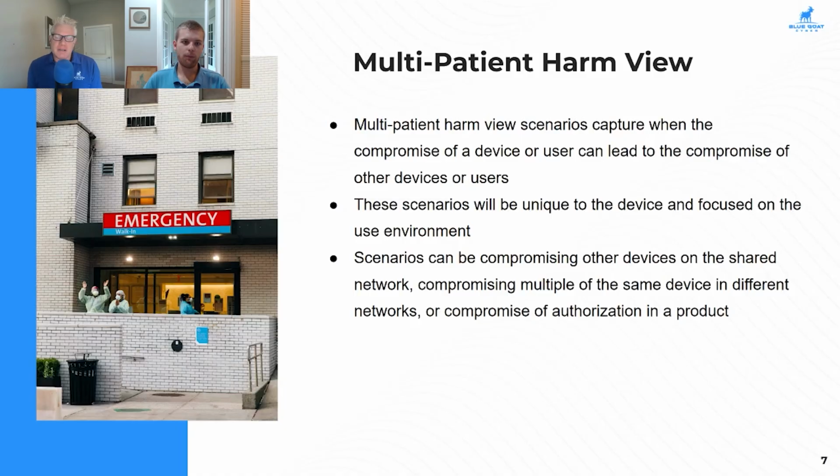So the multi-patient harm view, I think, is a critical one to discuss, because the whole idea is, if I am able to compromise one system, can I affect multiple patients? Or one vulnerability, I should say. It's sort of like with Shellshock or Log4j.